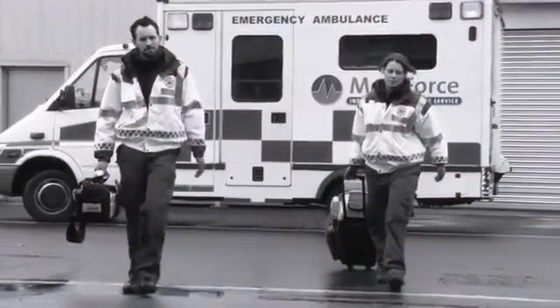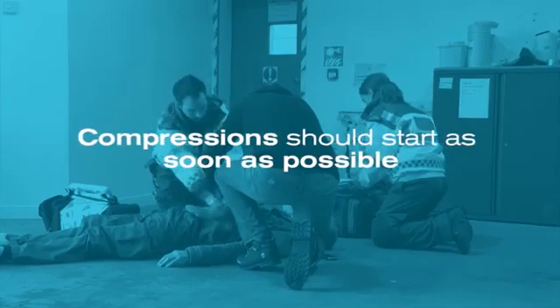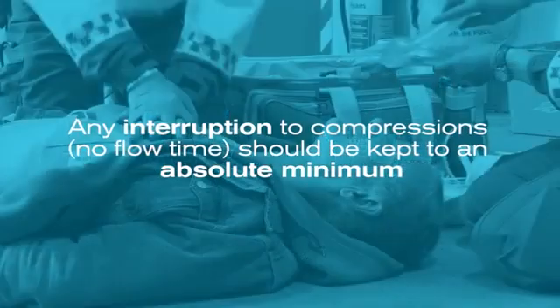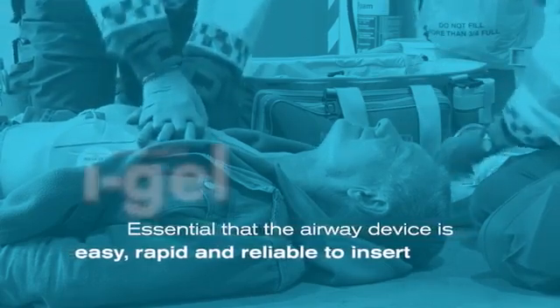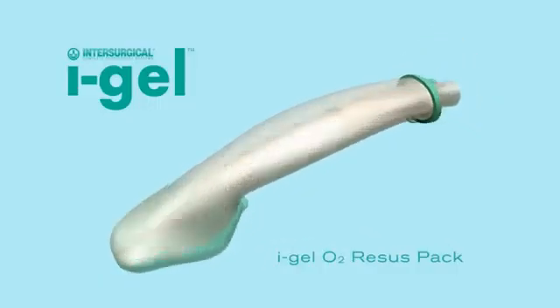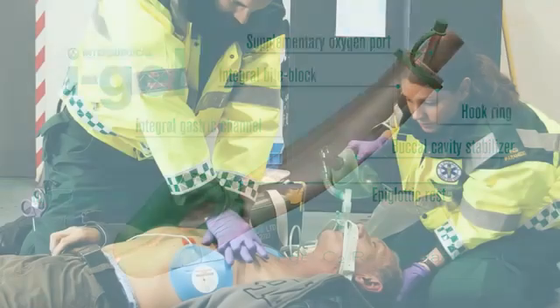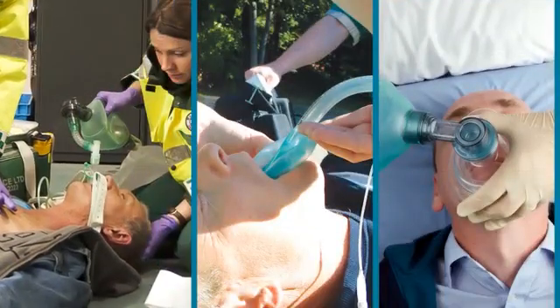When you arrive at the scene of a cardiac arrest, time is critical. Compressions should start as soon as possible and any interruption to those compressions, or no flow time, should be kept to an absolute minimum. It is therefore essential that the airway device is easy, rapid and reliable to insert. Eye Gel is a supraglottic airway with a non-inflatable cuff, gastric channel and other features that make it an ideal choice for cardiac arrest in comparison to more traditional devices.